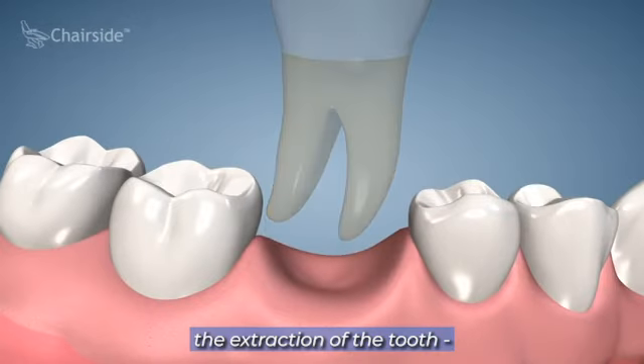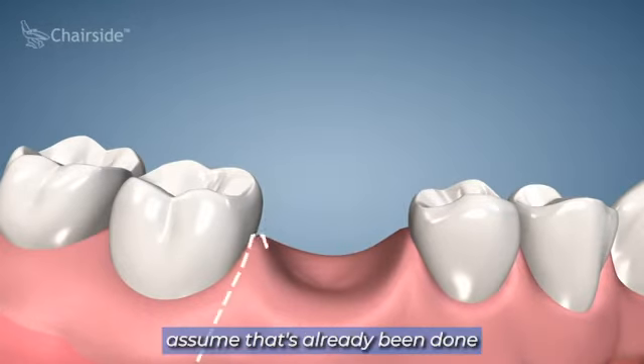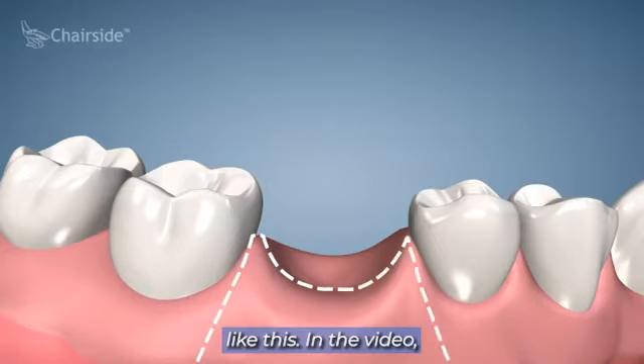In the video right now they're showing the extraction of the tooth. Let's just assume that's already been done and it's healed. The site will look somewhat like this.